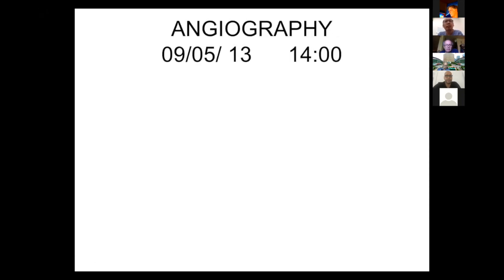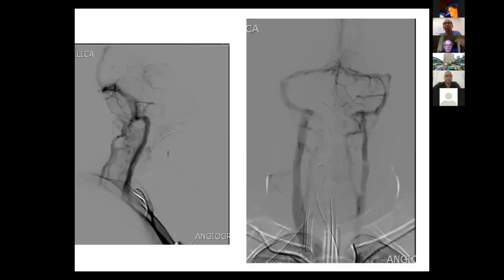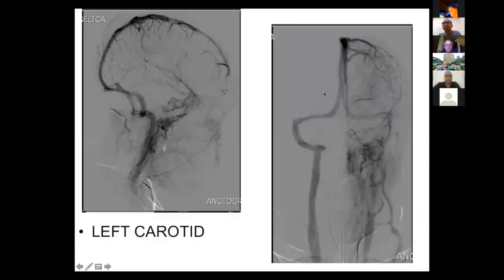Conventional angiography was performed at two o'clock in the afternoon. In the late phase of the vertebral injection, you can see very good arterial circulation, but the straight sinus is not visible — only the longitudinal sinus. On the left and right carotid injections, the longitudinal sinus is visible, but the straight sinus and the internal cerebral veins are not seen.